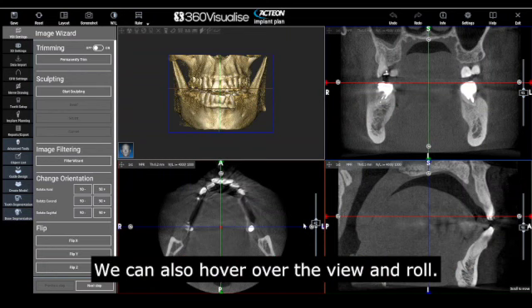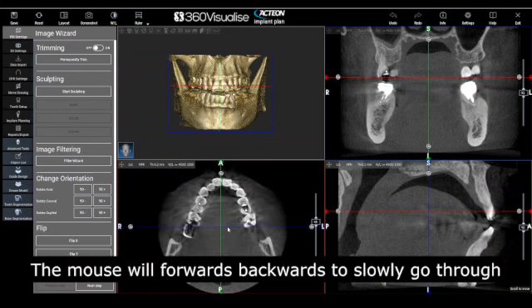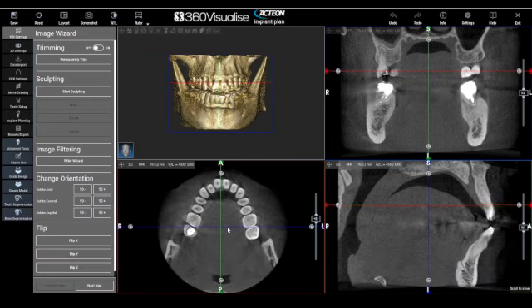We can also hover over the view and roll the mouse wheel forwards and backwards to slowly go through slice by slice.